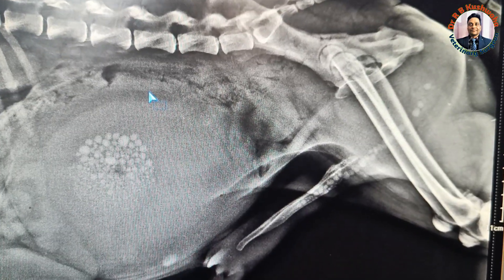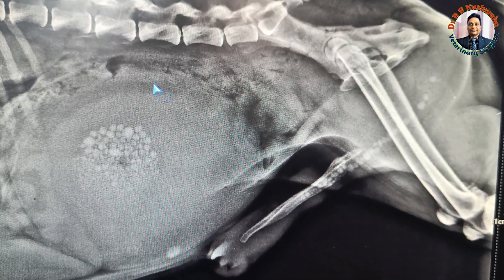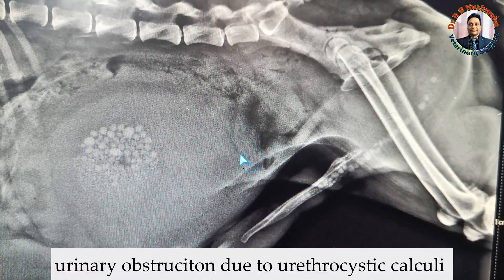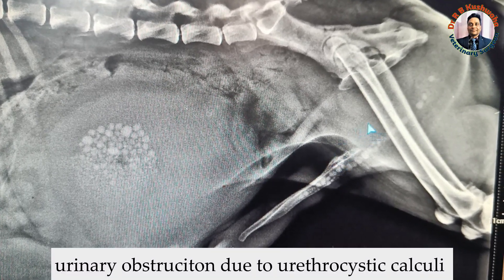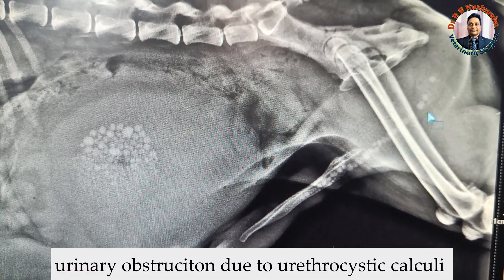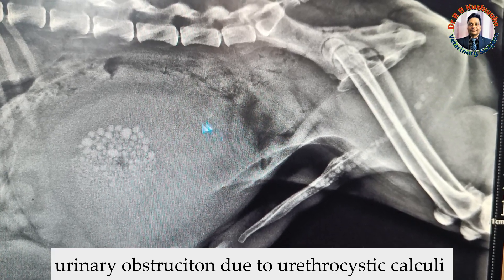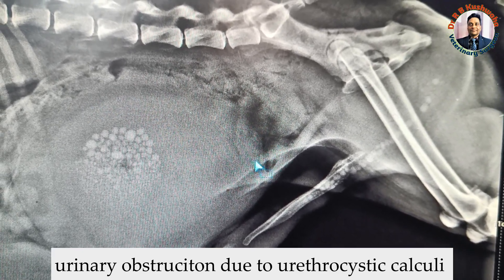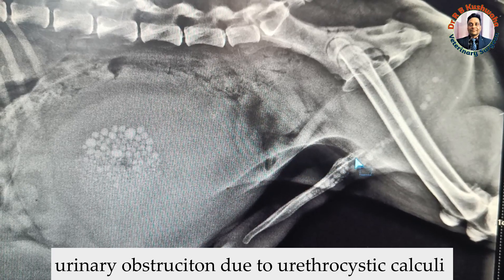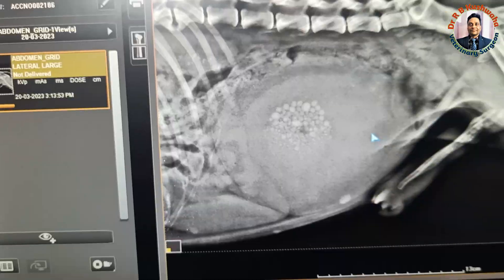Based on the radiographic features, we can diagnose that the animal is suffering from urethrocystic calculi — meaning calculi are present in the urethra as well as in the bladder. Combined, we call this urethrocystic calculi.